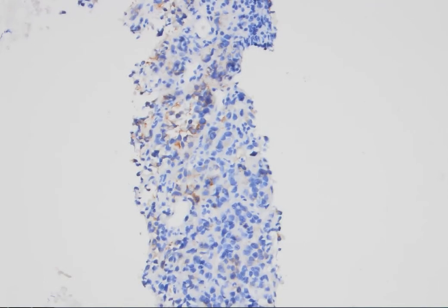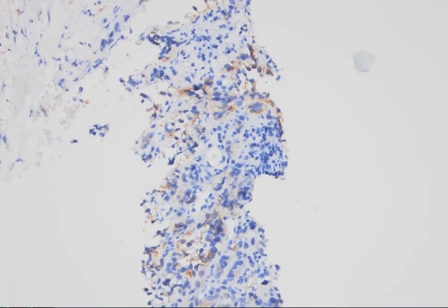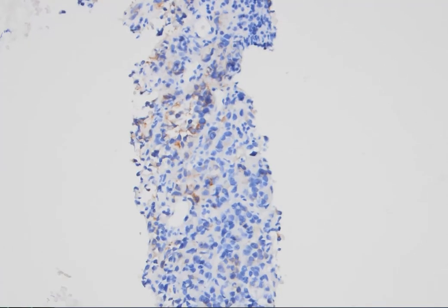Here is the synaptophysin positivity, but I did several immunos, and the tissue has finished. So I reported this as a malignant tumor with neuroendocrine marker expression.